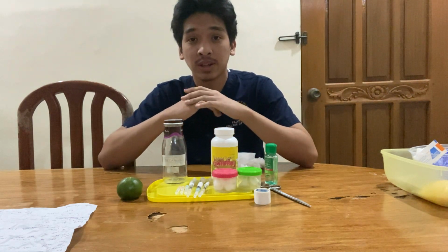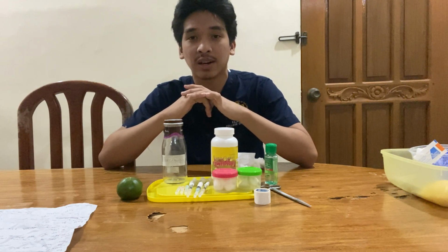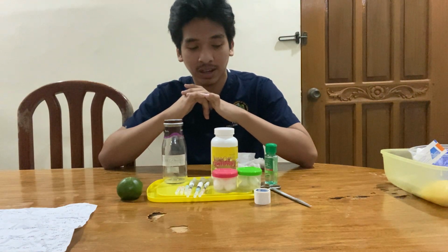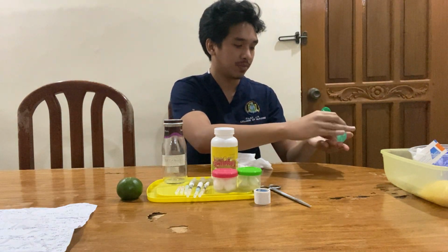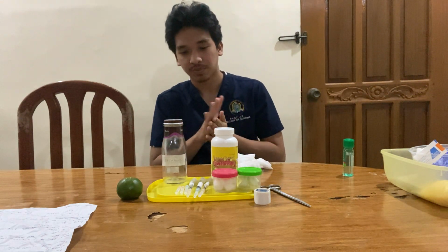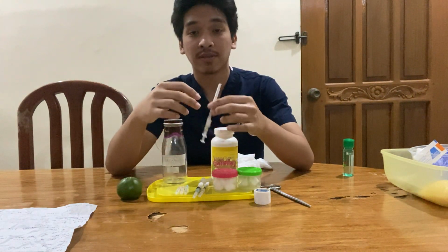So now I will read and consult the policy regarding the aspiration of intramuscular injection. And after I've done that, then I hygienate my hands, wash my hands. So assuming that I've washed my hands, I will now draw the medication from the vials.